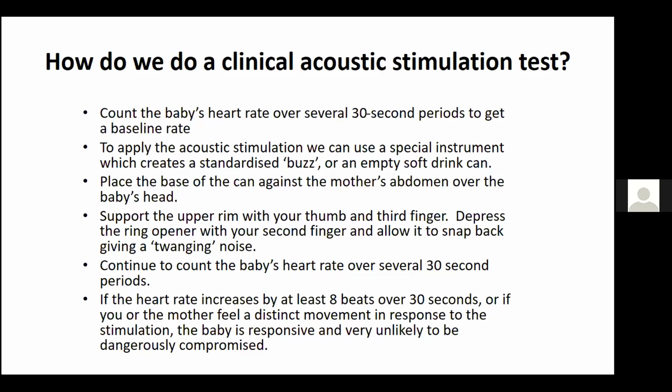And then at 50 minutes, it's actually the deciding time, right? If it remains flat, it's time to really notify your senior, call someone so that we do not delay our CTG. And then the second thing, you continue the trace.